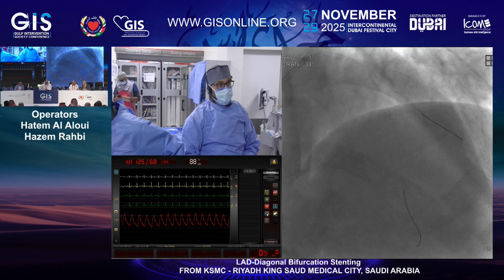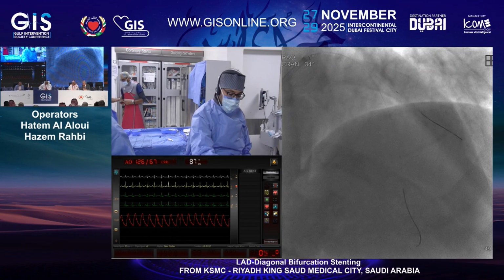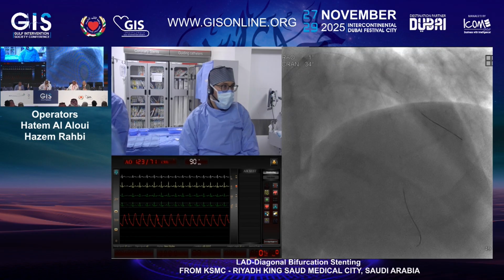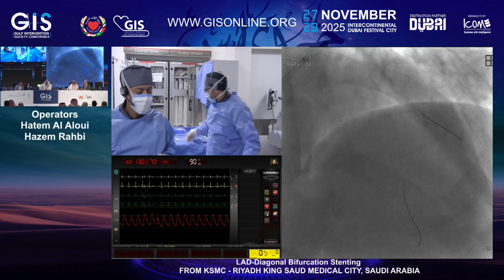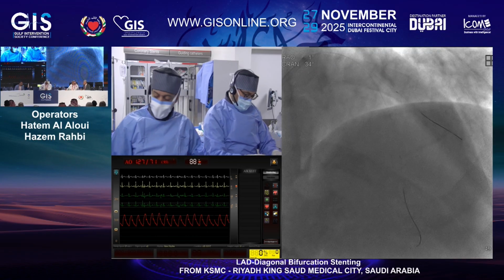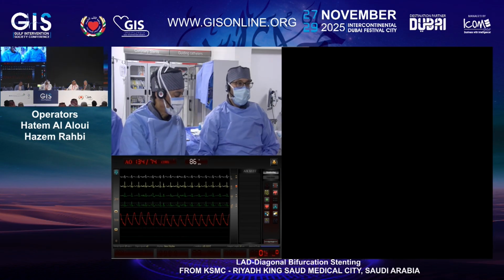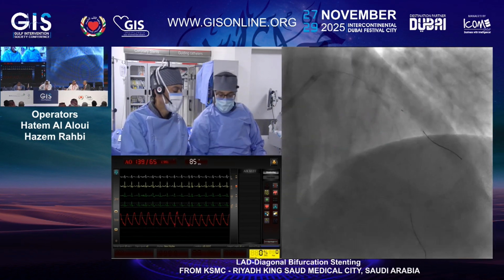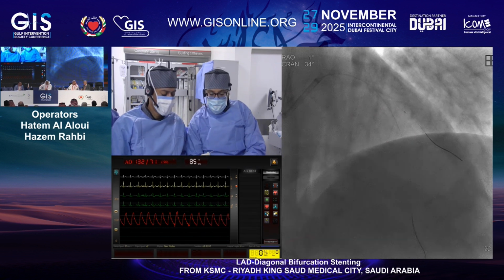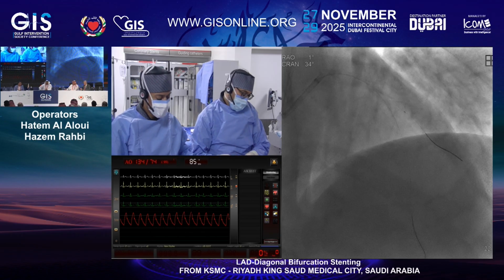But here, although Selution is probably one of the best in terms of trackability and crossability, this is not really the reason why I'm using it. Is your question about the drug itself? No, but Selution, because of the latest data. It's a sustained release of the drug that makes a difference. Sirolimus, not paclitaxel. It's the way they apply the drug with the micro reservoirs. It's really unique.